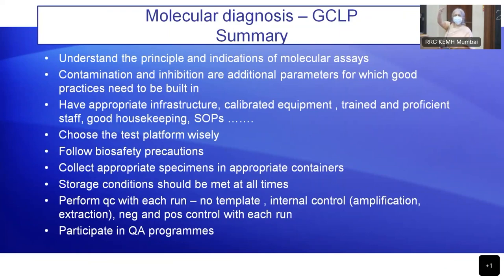Next one, please. Storage conditions should be met at all times. So, if I want to store something for only one day, what temperature? RT. If I want to store DNA for longer, what temperature? If I want to store RNA for longer, what temperature?